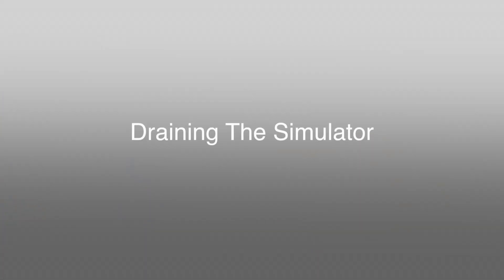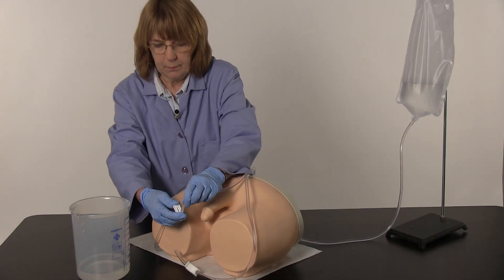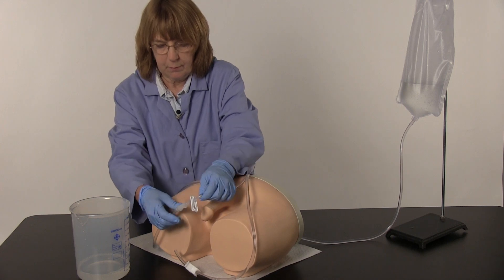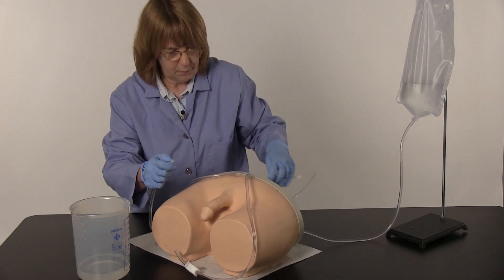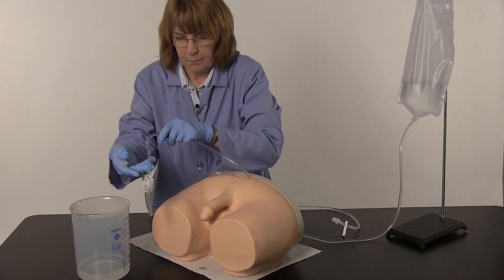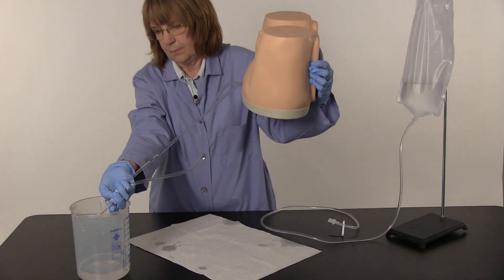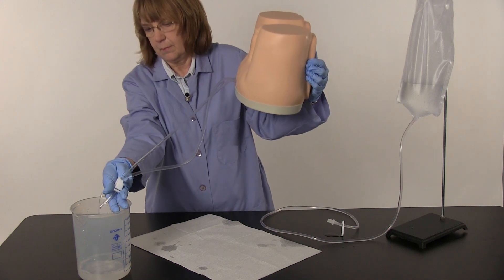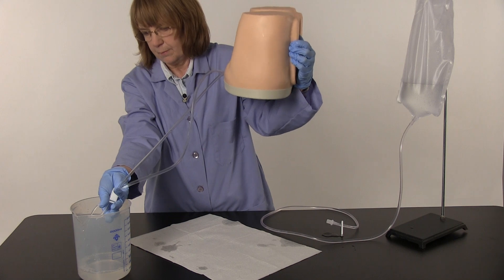Draining the simulator. Perform this procedure near a sink or with a water-safe basin. Slide the clamp closed on the fluid administration set. Disconnect the quick disconnect fittings. Turn the simulator over onto its plastic base. Elevate the simulator and place the tubes in a water-safe basin or sink. Open the pinch clamp on the drain tube and allow the water to drain from the simulator's tubes.